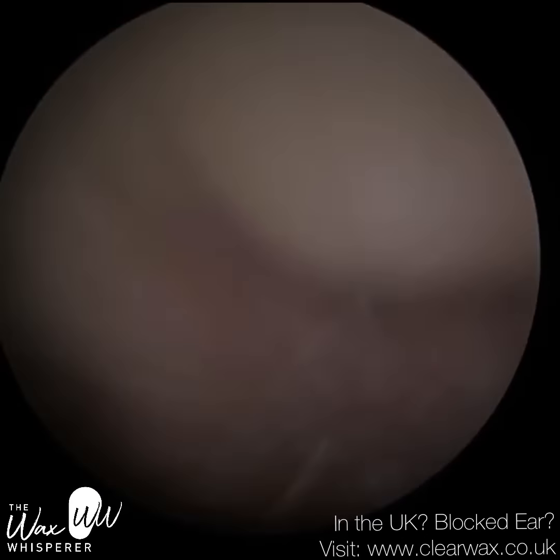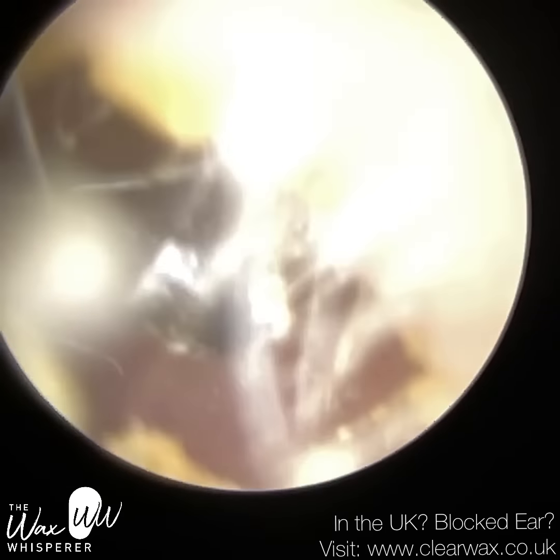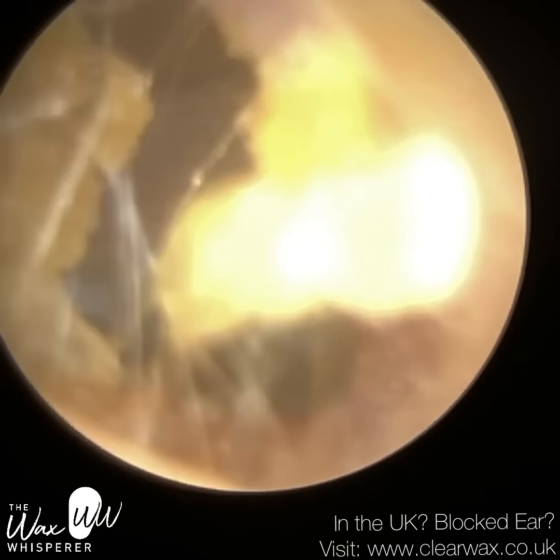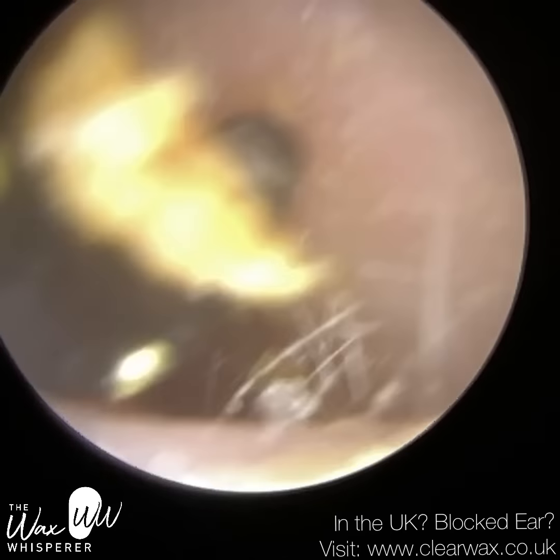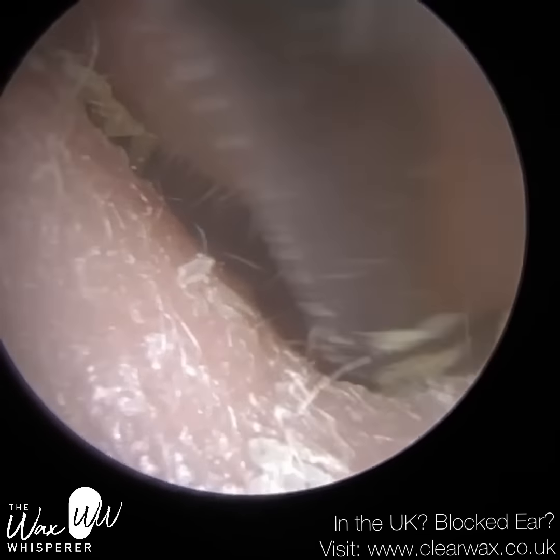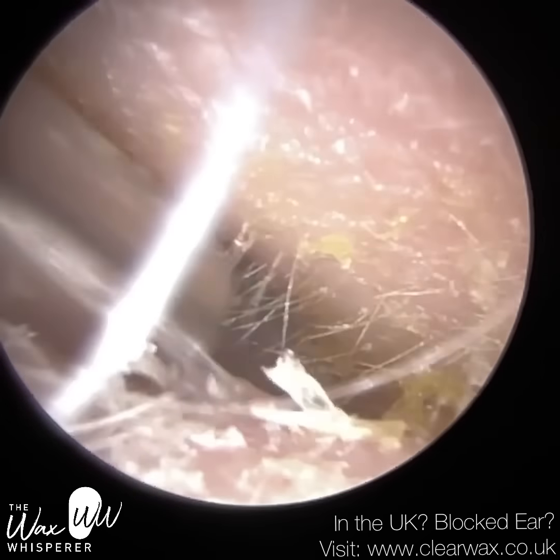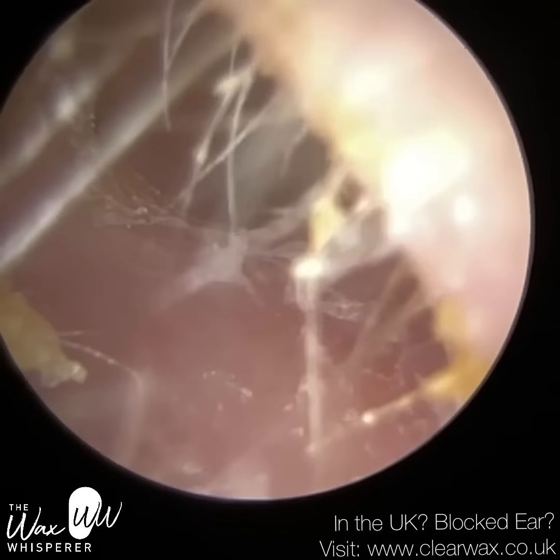That's the patient's eardrum. There's some dead skin at the entrance. I'm going to just use the hook to leverage out, and a bit of microsuction as well. It's the cartilaginous portion now, the outer third. You can see all the cilia there, which are exclusively found on the cartilage portion of the ear. You can see you've got some good dry skin. It's quite an elderly patient, so as we get older, it's just a natural phenomenon. Our skin cells and other cells are unable to retain moisture fluid as well, so skin does dry up.